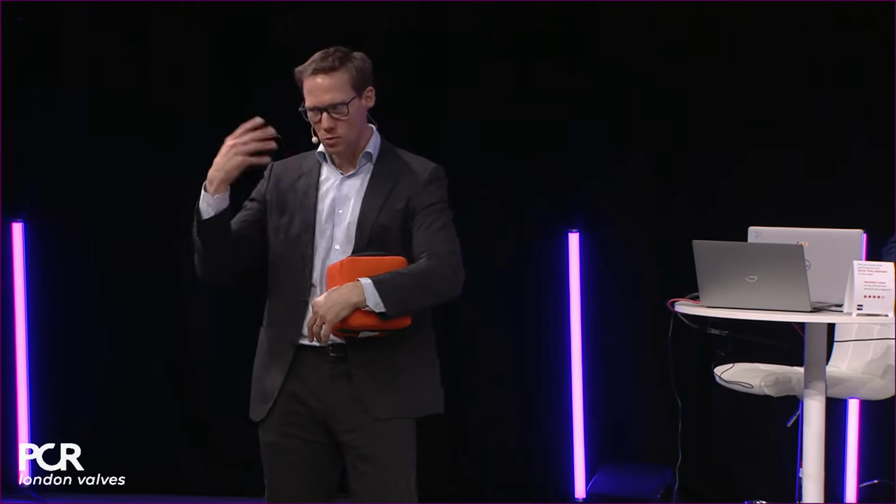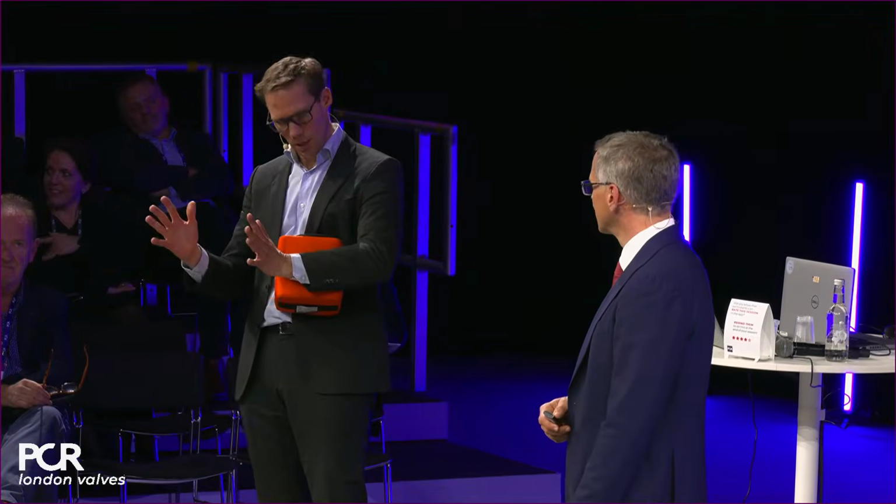So I don't know that the balloon stability and leak around the side really helps you. I think it can add to what you think. I would look at this and I would think, ooh, that balloon's not open. So I would think about dilating again, dilating with a bigger balloon, ensuring that I had it open before accepting that as a balloon. I would personally be a bit scared going with a bigger balloon than 24.